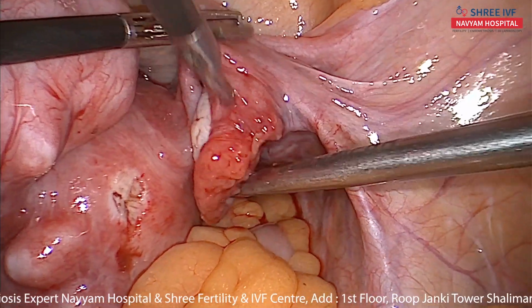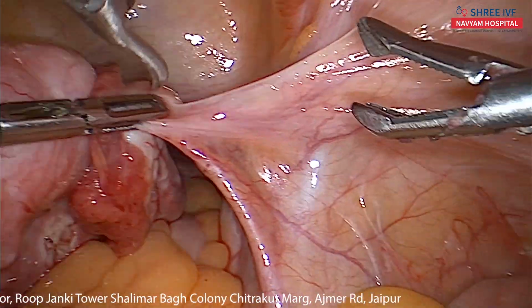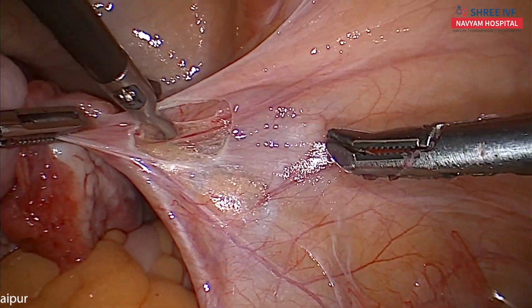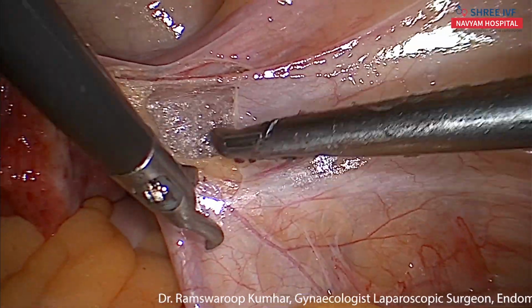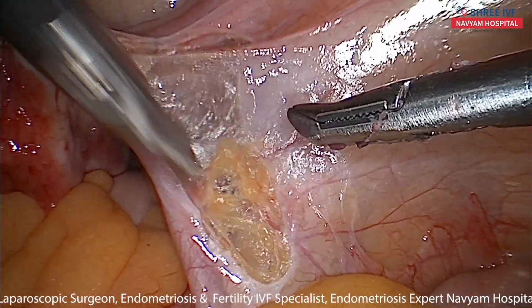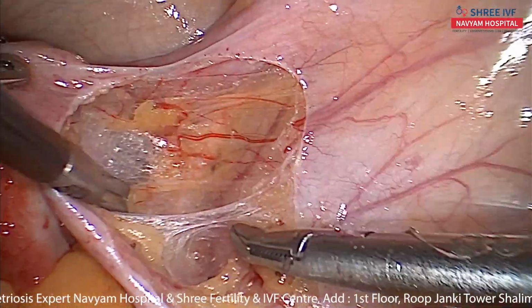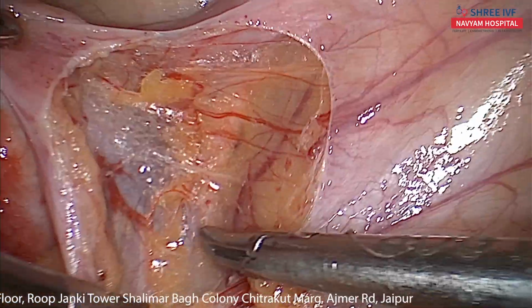So for that, first we hold the IP ligament and give traction medially, and open the retroperitoneum lateral to the IP ligament. Now the first structure we have to identify is the ureter.